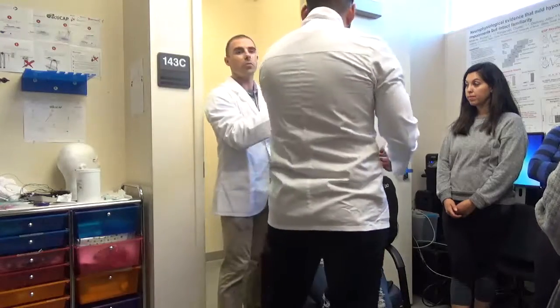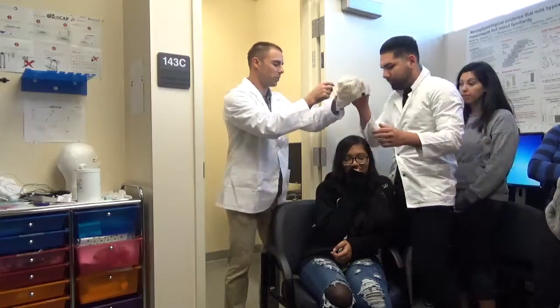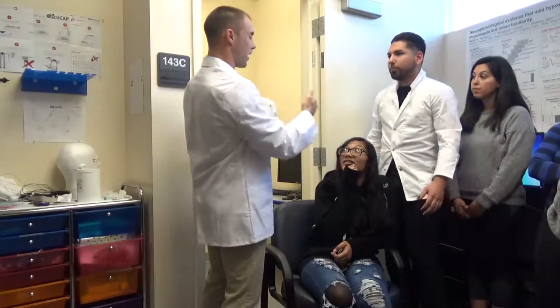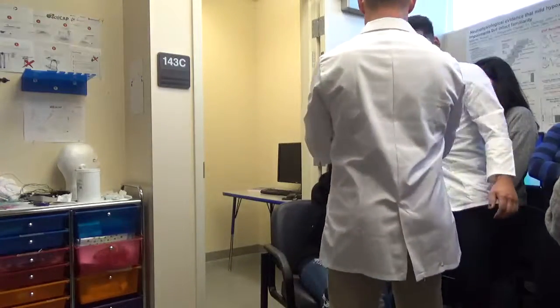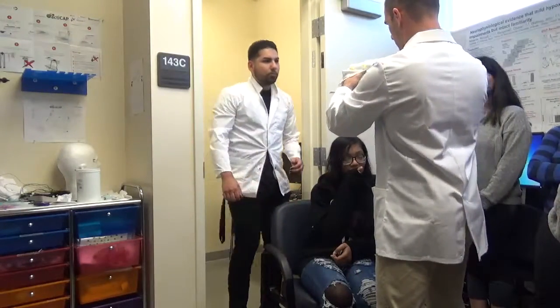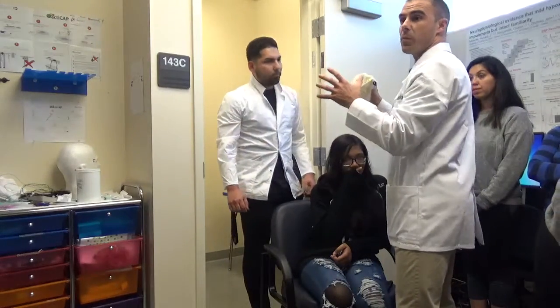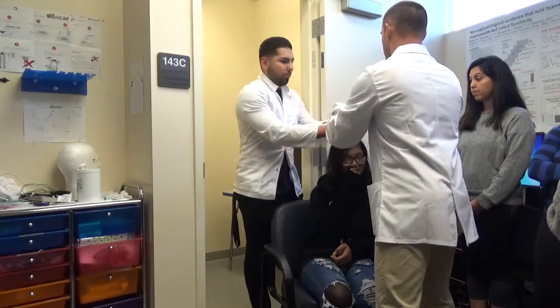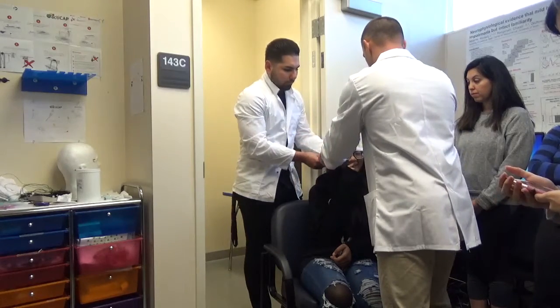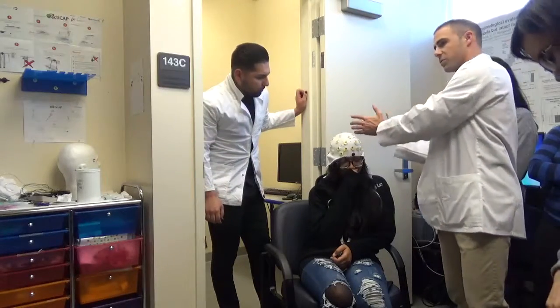What we will look to do is put this in the middle and line these up over the eyes. Well, actually, I'll tell you what. The way we usually do this is not laterally, but front and back. So if you stand in back of her, you have to move her hair so you can get the... Yeah, we will. So I'm going to show you guys how we put it on first, then we're going to take it off, and then we'll set her up a little bit better. So grab the back there, and we just start in front and then pull it down, and around. Now, see how that's rotated and shifted? All right, we're going to have to shift that back.